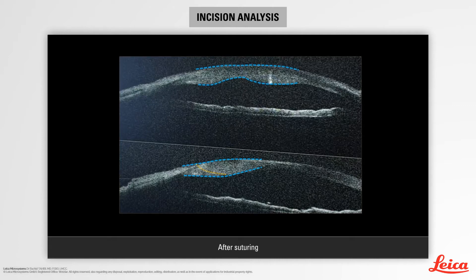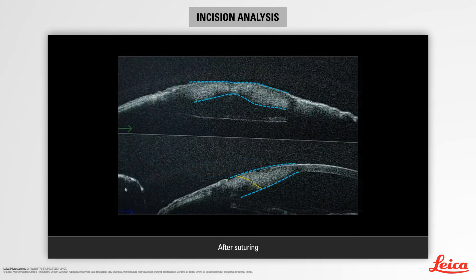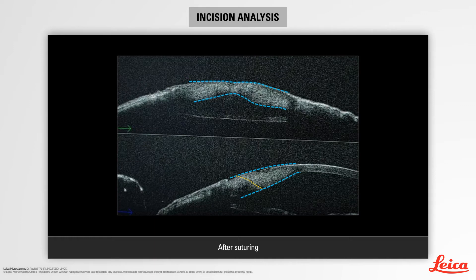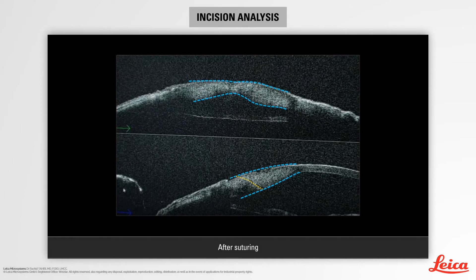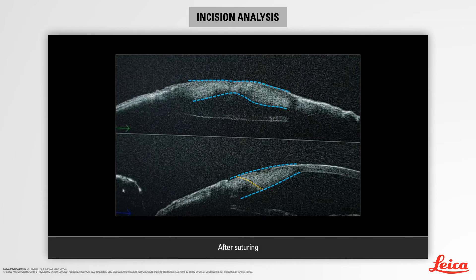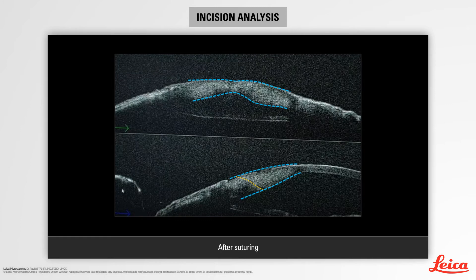It is especially noted that the curvature of the anterior face remains almost unchanged. Then, the modification of curvature mainly concerns the posterior face, which becomes a double bump.